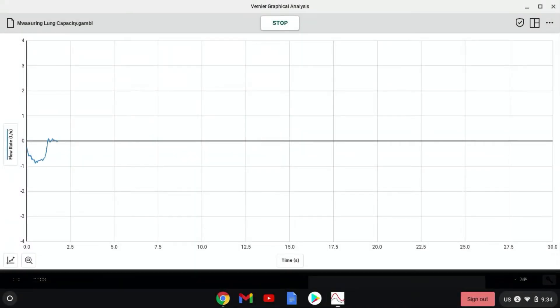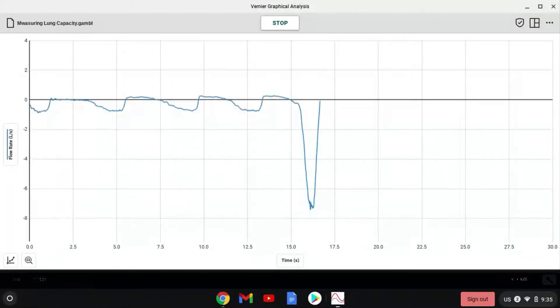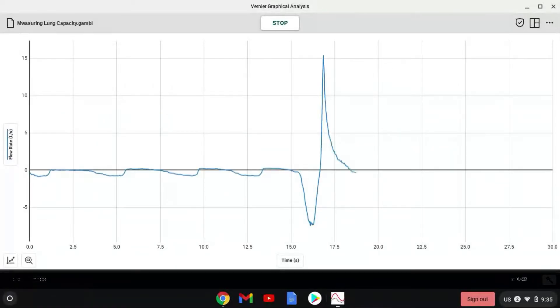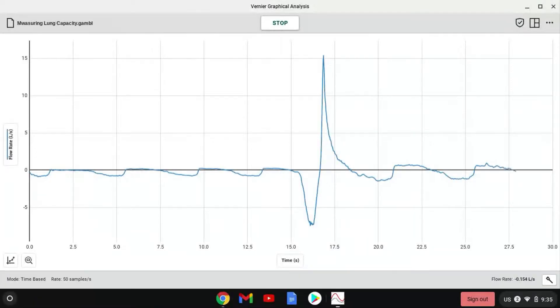Okay, I'm going to go ahead and get ready. Are you ready? And here we go. You begin. Big breath in, big breath out. And there we are — we have our data. We can go back and analyze it and see how she did and what her lung volumes are.